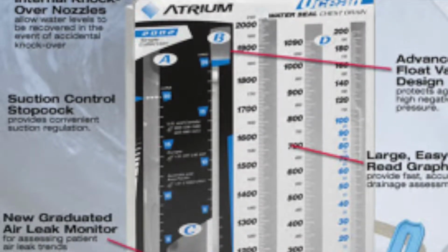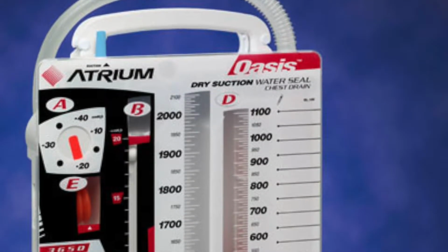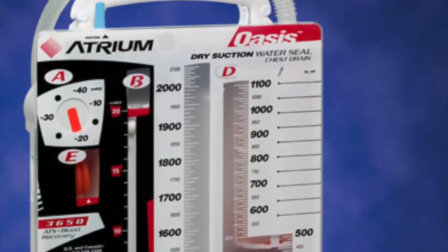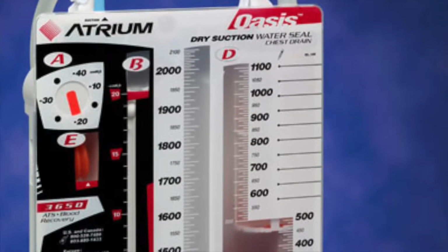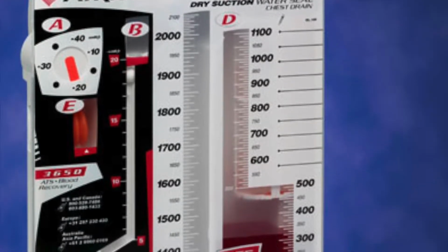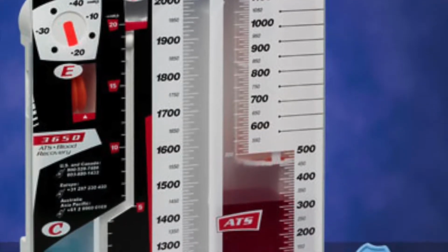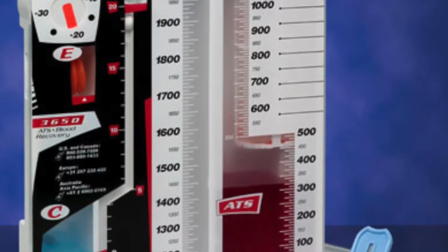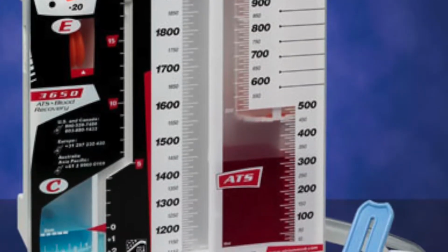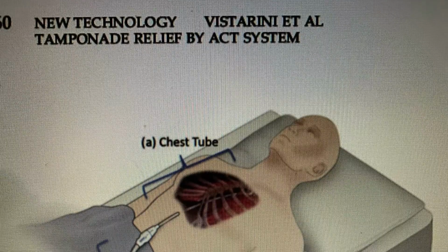The second type of chest tube is dry suction. There is no water column to control suction, but it uses a suction monitor bellow that balances while suctioning. Based on what the physician orders, you can adjust the suction pressure by using the rotary suction dial on the side of the system. This type of chest tube has higher suction pressure options, no bubbling of water, and no water evaporation. The third type of chest tube is the mediastinal tube.